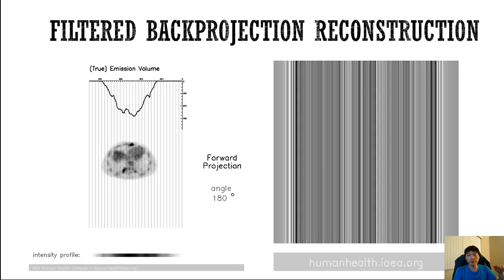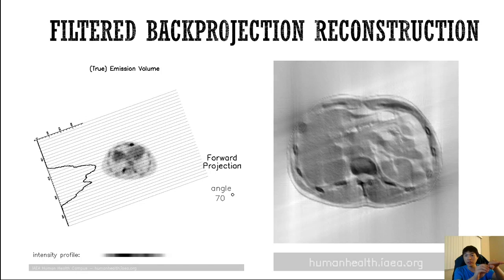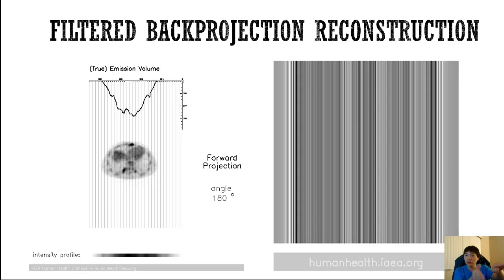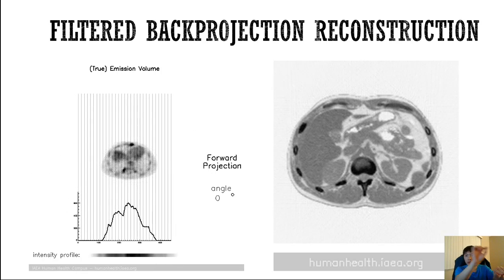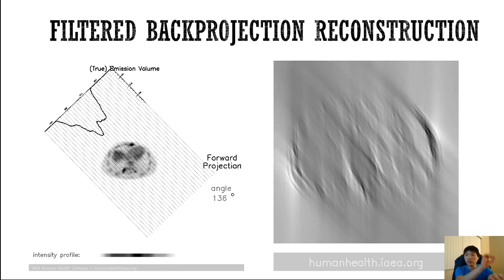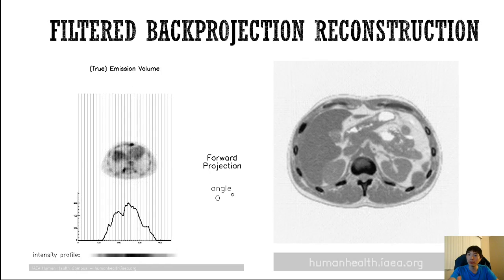And if we slide the patient in, we can either do a step-by-step CT where we do a ring around and then slide the patient in a bit further and then do another ring. So it's kind of like a step-by-step approach. Or the more modern CTs keep going round and round and round. So it's a continuously rotating gantry, and so the patient just continuously slides through, and you get a helical acquisition, and then we can reconstruct a 3-dimensional volume of our patient.